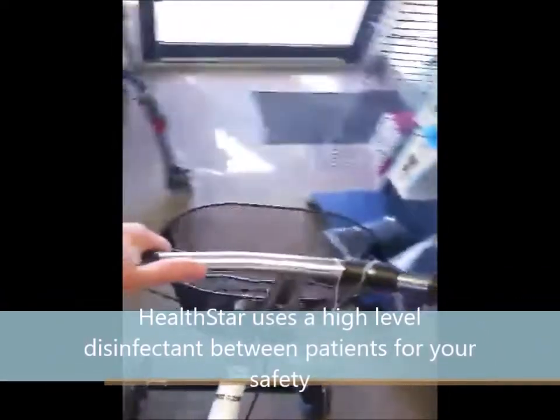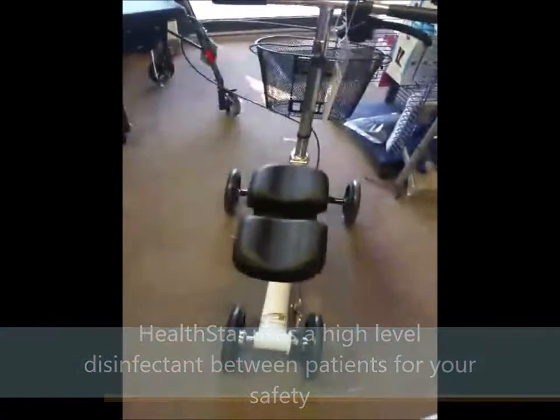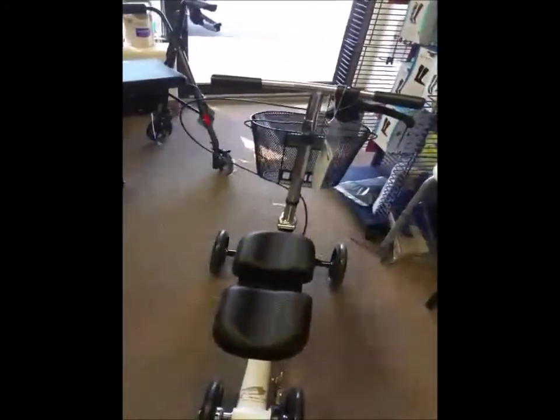This is a short video on using a knee scooter and adjusting it. It's relatively simple. Knee scooters are used for ankle injuries or surgeries where the patient will be wearing a cast or a boot.